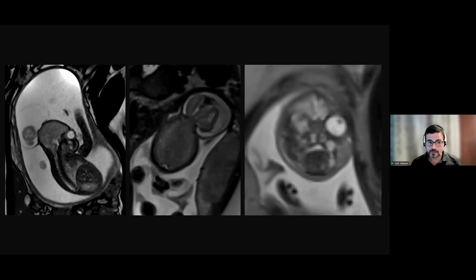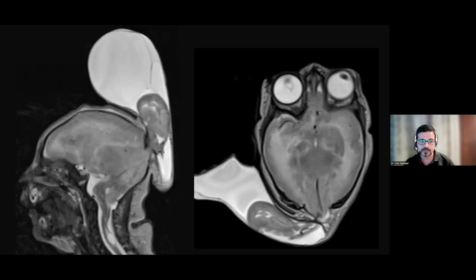So, well, we may not have got to the bottom of this, but depending on the shape of the brainstem, you might even engender a guesstimation, or an educated guess at least, of what this might end up being. We do have the very early day one scan, where the surgeons were more keen on sharpening their tools in order to get this brain back into as much position as they could. But I think this picture tells you the rest of the story. And this is indeed a case of an alpha dystroglycanopathy, with cobblestone cortex all the way through. This is a muscle-eye-brain kind of spectrum.